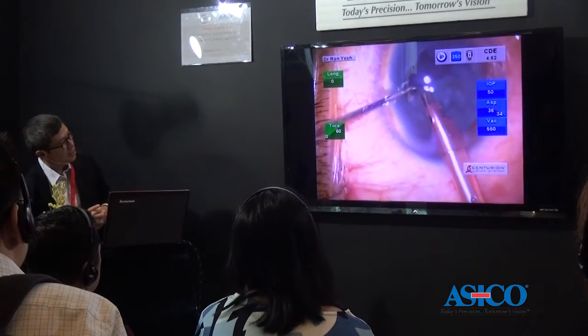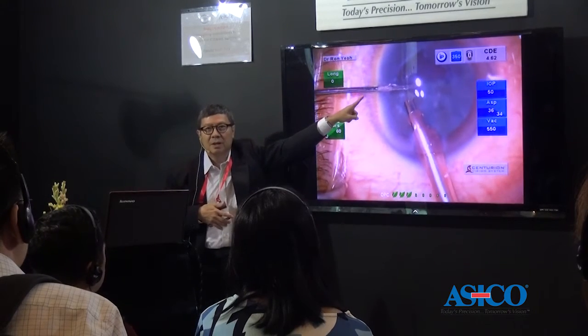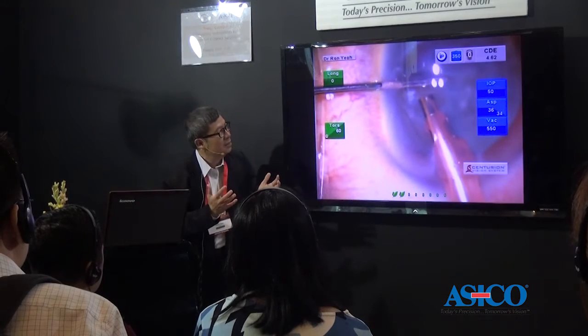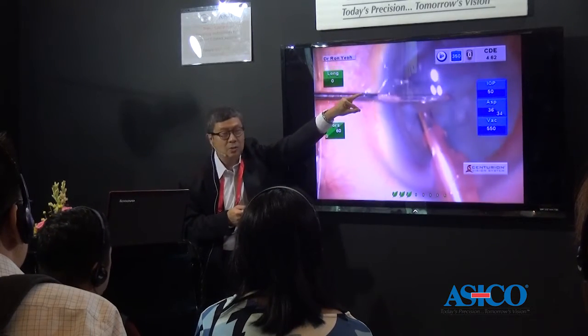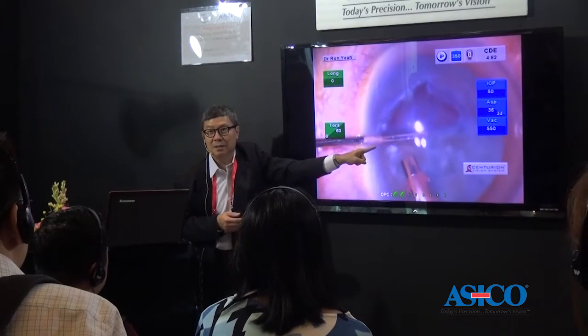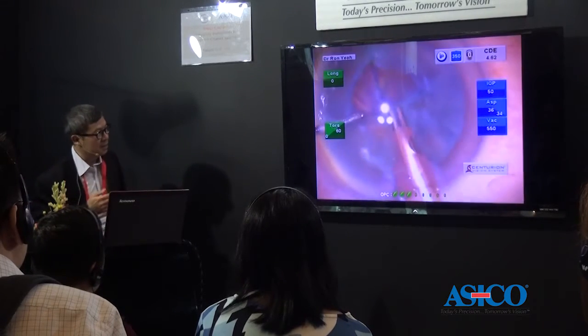Now, you'll see when I insert the instrument in, and I'm trying to reach across, it's stuck here. It won't go anymore. It's watertight, but I can't chop. I can't rotate. It's a problem. So we need to then make it wider to allow it to go in. But when you're making it wider, it will leak when this part is in. And that's something I think we haven't paid attention to enough over the years.